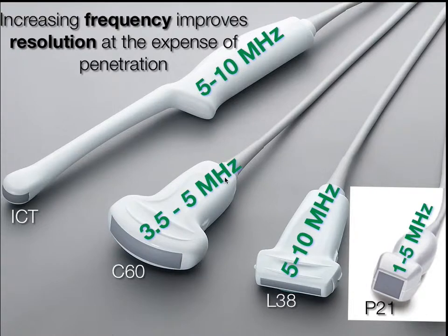In fact, to try to find the ovaries using this lower frequency transducer or this one can be quite challenging, especially if the patient has any amount of abdominal wall fat, whereas this high frequency transducer is sort of like the BMI equalizer. I can always find the ovaries going through the endovaginal route, turning up the frequency, being much closer to that organ of interest.